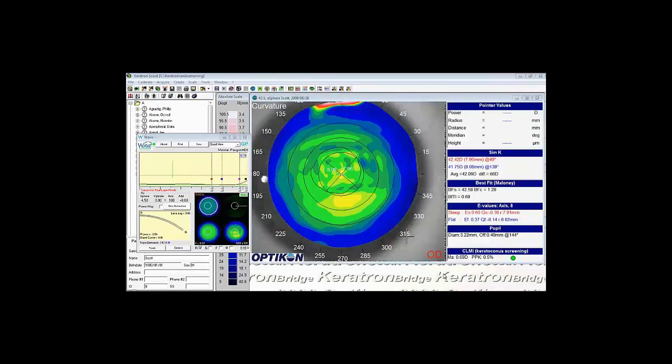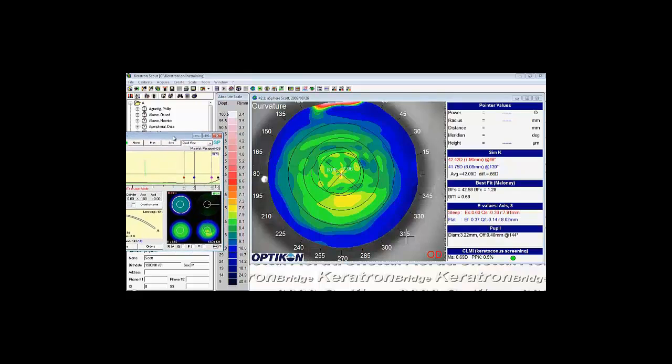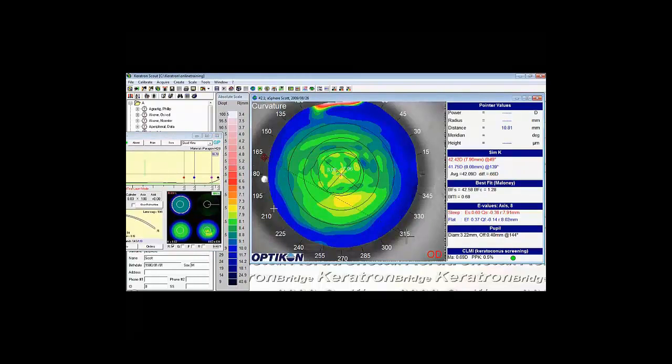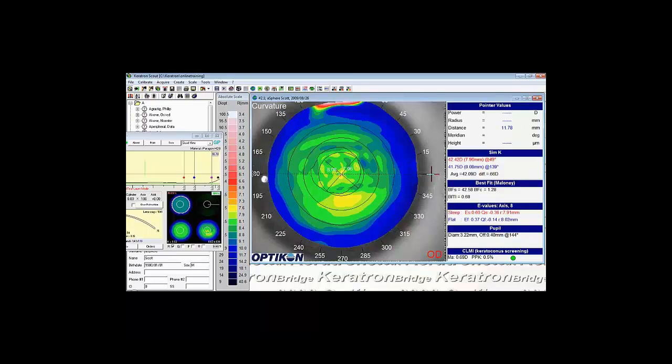As we go over the core design decisions when making a wave contact lens, we'll be using this corneal topography, and this is the default lens design that was opened up based upon this topography. So the first decision we'll make is the contact lens diameter. What I suggest doing is using the caliper within your topographer to measure the horizontal visible iris diameter.